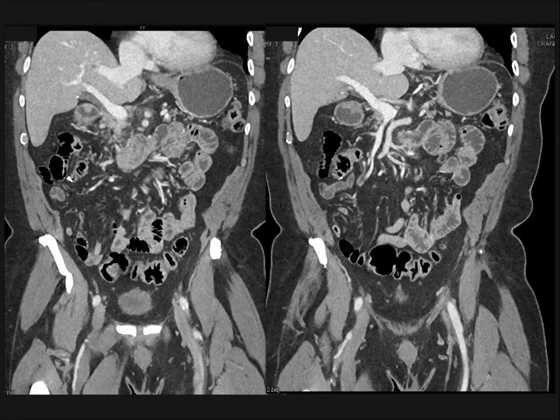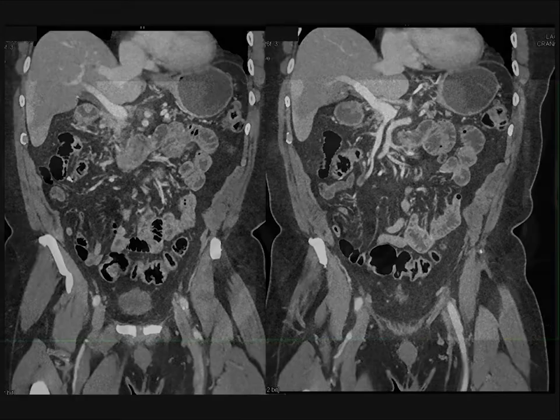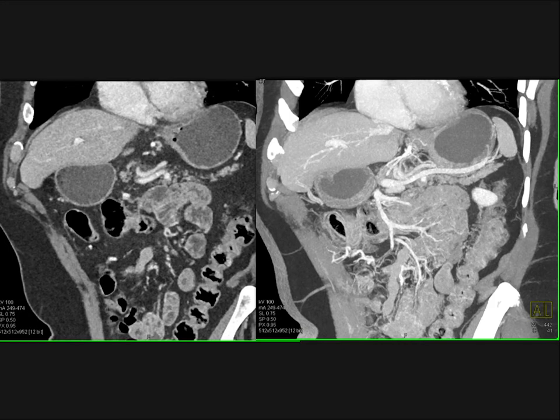Now, what else could this be? It could be an adenoma. It could be a GIST tumor I mentioned. It could be a pancreatic rest. The arterial phase can be helpful, though of course we know that GIST tumors can be very vascular as well, as can pancreatic rests. So here you see an image on the left, and on the right, you don't. So it can be very subtle to pick up. And as you can see from these images, it's very, very easy to miss.